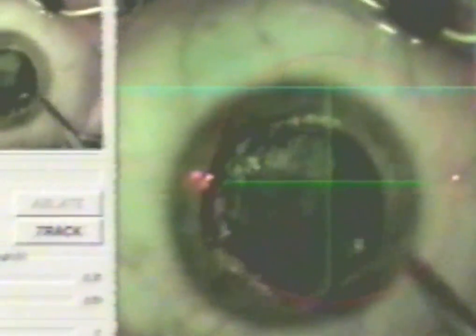One final use of the broad end of the spatula is to remove epithelial ingrowth. You can see there is epithelial ingrowth on the left side of the picture. The semi-sharp edge of the spatula makes a nice blade that will not cut or damage the flap or the bed, but is sharp enough to clean off peripheral epithelial ingrowth. I'm using it to push the epithelium off the bed and out to the periphery, so that in this patient who then underwent an enhancement, there is no recurrence of the epithelial ingrowth.